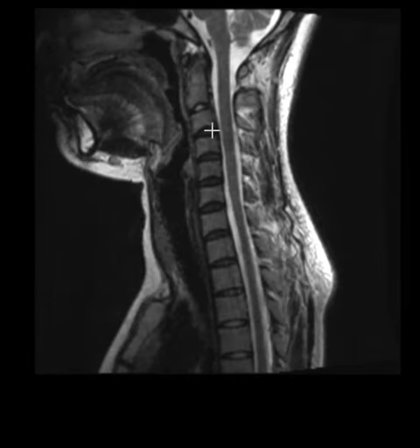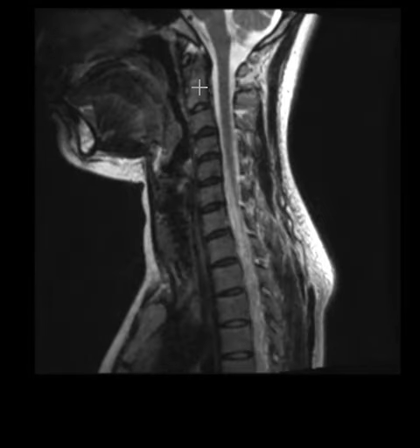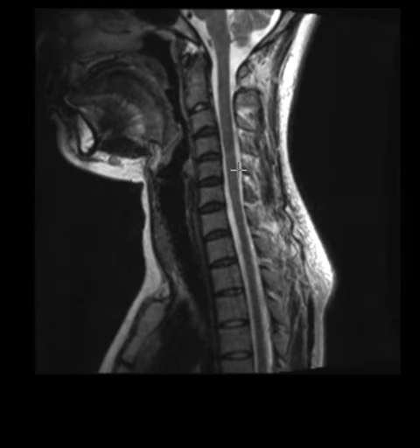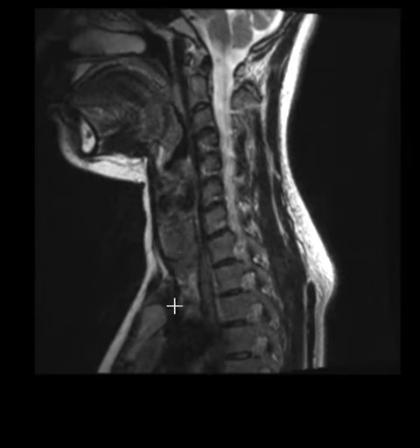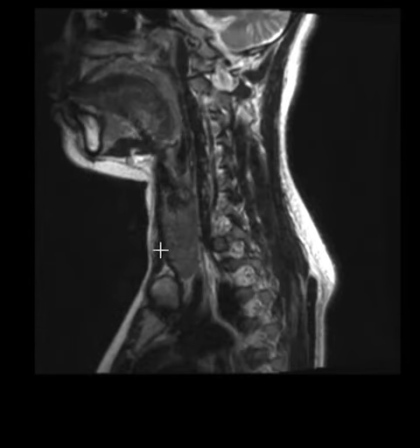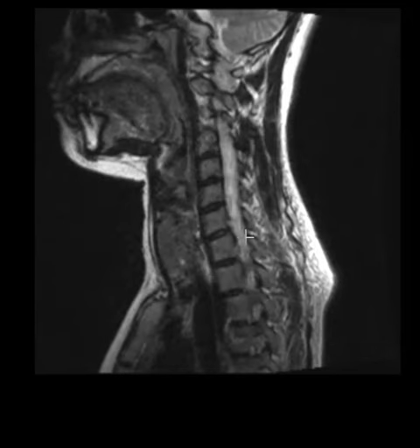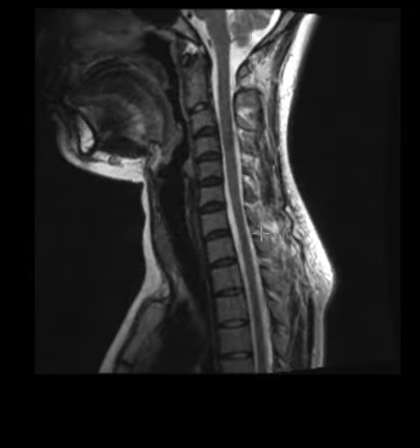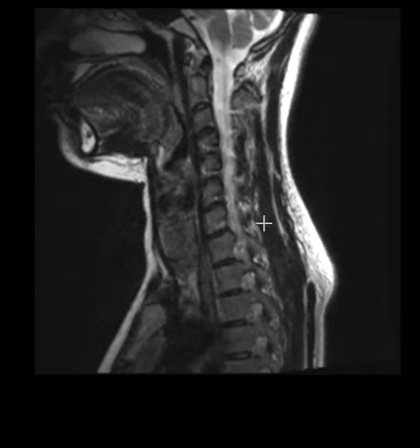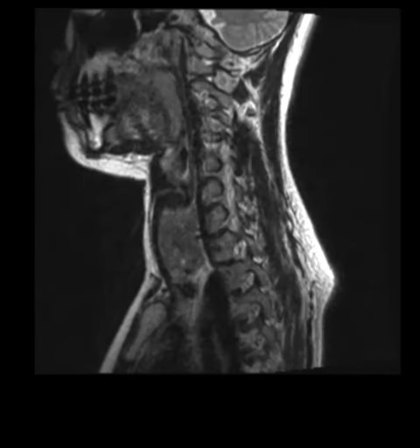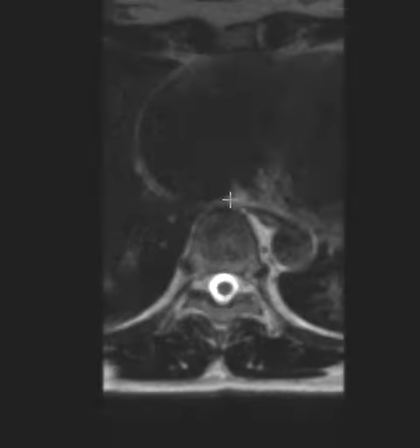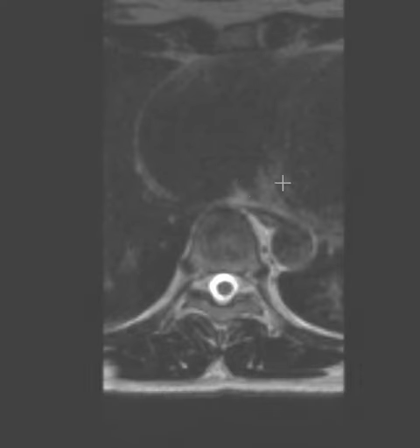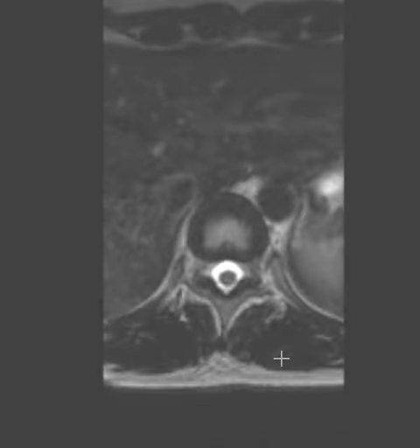We also do an MRI of the cervical spine, just a more limited view, just to count the segments. We have to count down from the cervical spine to see where we are and count the vertebral segments. In this one we get kind of a free look of the cervical spine and neck soft tissues, and we see this big thyroid gland. So we call this a thyroid goiter or hyperplasia of the thyroid gland. She has a normal thoracic spine.